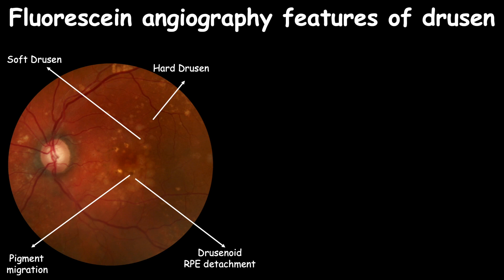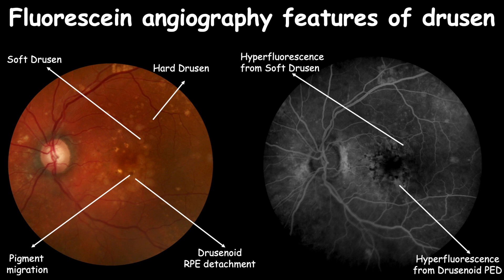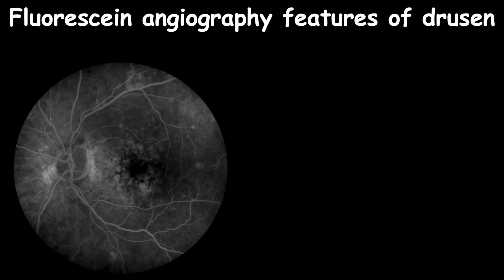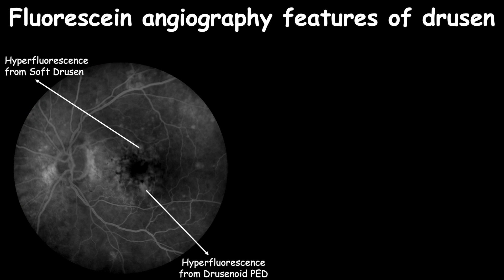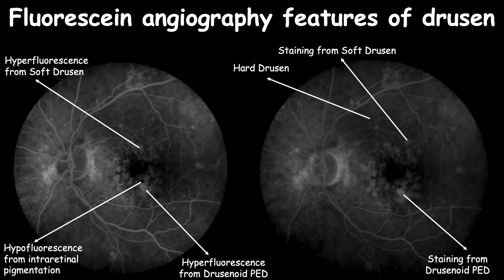The fluorescein angiogram shows hyperfluorescence of soft drusen and drusenoid RPE detachment in the early phase, where hyperfluorescence is maintained without increase in size in the mid-phase, with more prominent hypofluorescence due to intraretinal pigmentation. The late phase shows staining from both the RPE drusenoid detachment and soft drusen, along with hyperfluorescence from hard drusen and hypofluorescence due to intraretinal pigmentation.